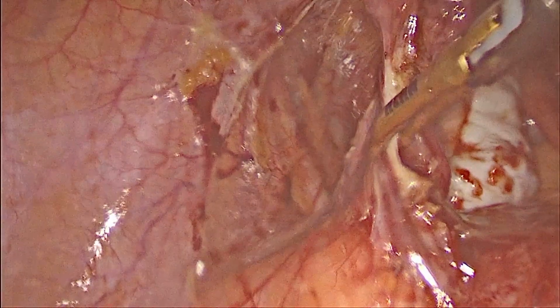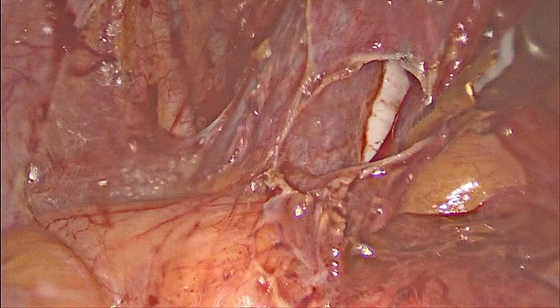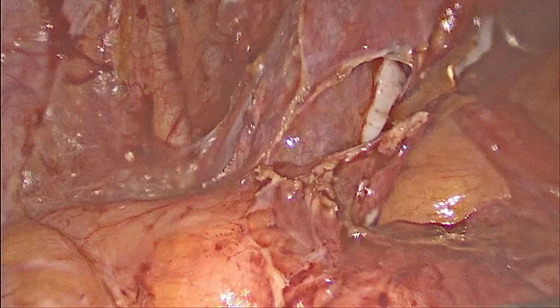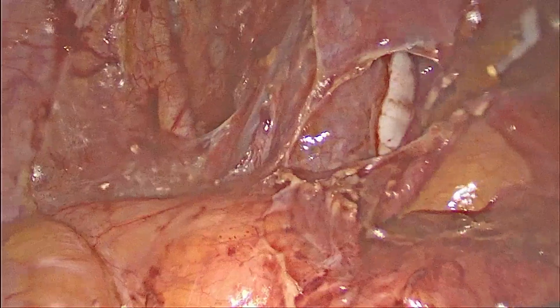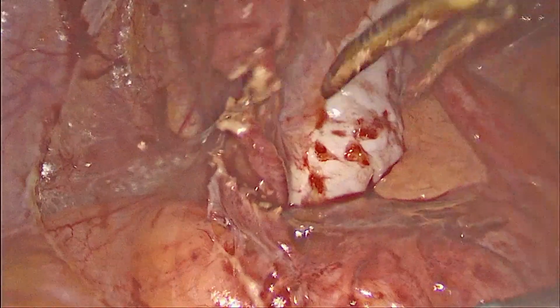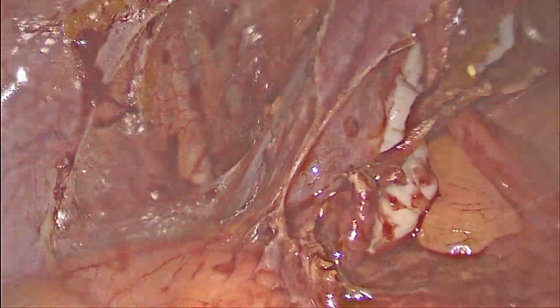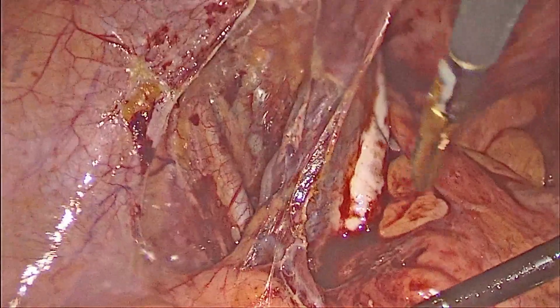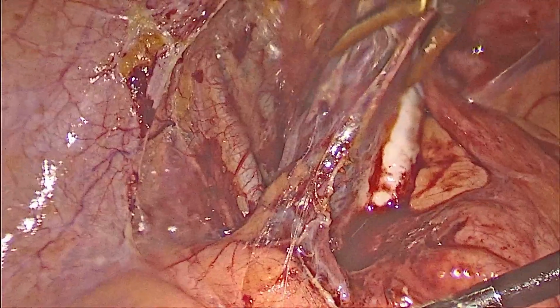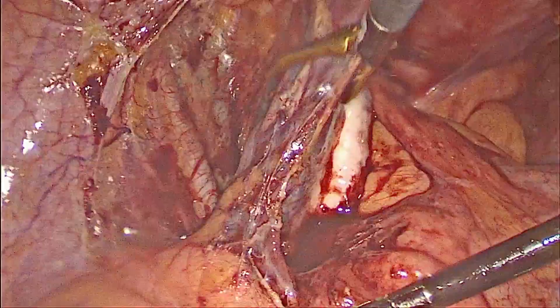While using the bipolar shears, we can see we are dealing only with the tip of the instrument, which gives a very good hemostatic effect with a sharp cut. So the infundibulopelvic ligament is identified, and we saw the ureter is well away from our surgical field.